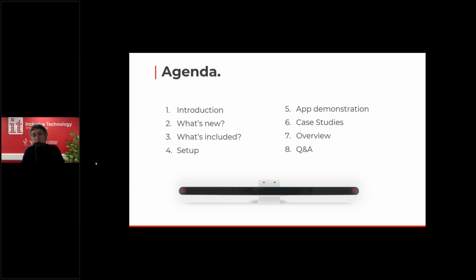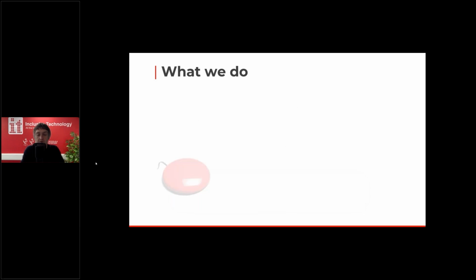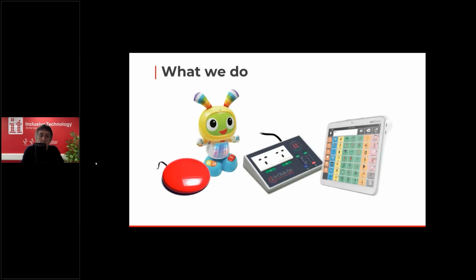Okay, so first of all, number one, let's look at the introduction. So what we do and who we are. I'm Ian from Inclusive Technology. As a company, we've been around for over 20 years now, based in the UK. We sell assistive technology, hardware and software. A few examples right there on the screen, the type of things that we sell, anything ranging from switches, communication devices, switch adapted toys, interfaces, you name it, we probably stock it.